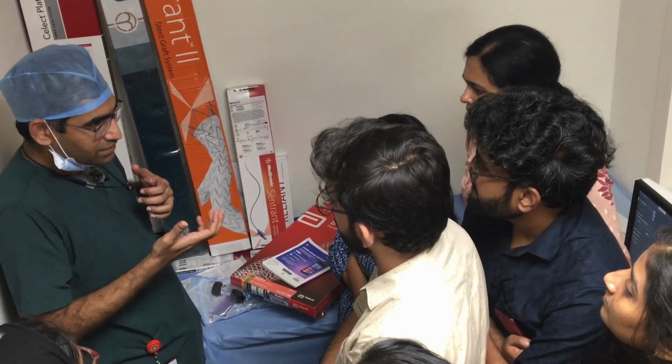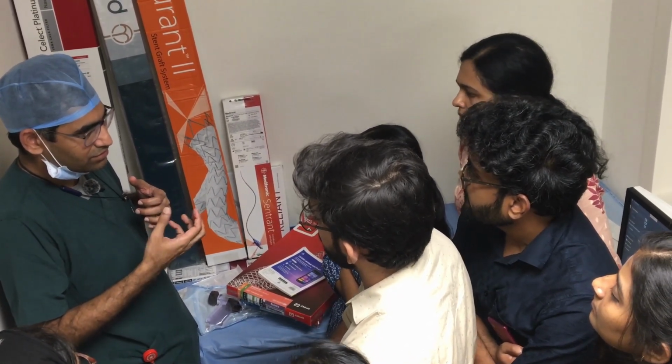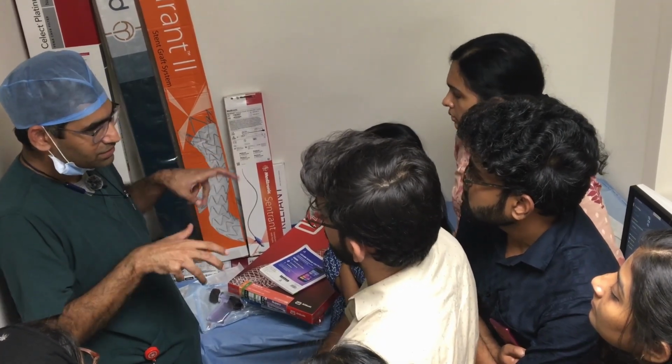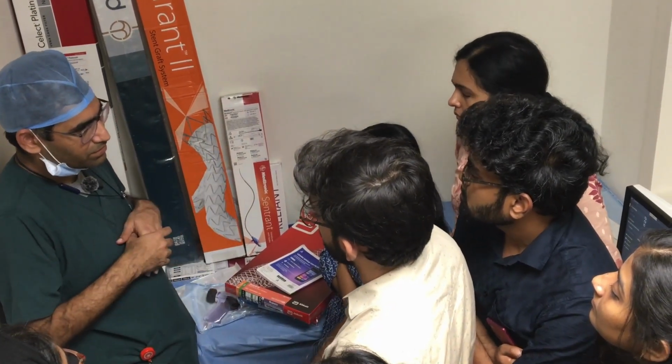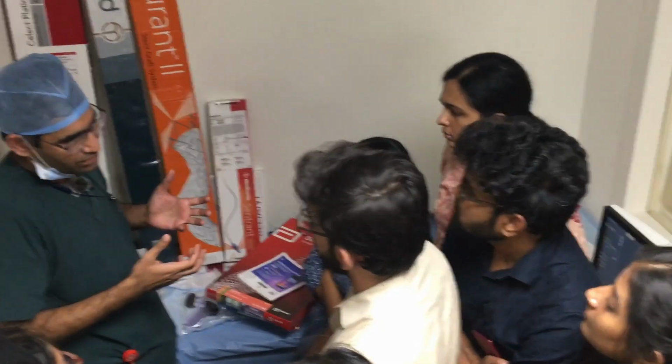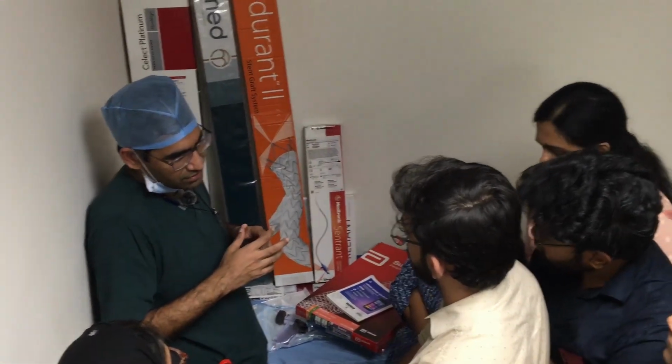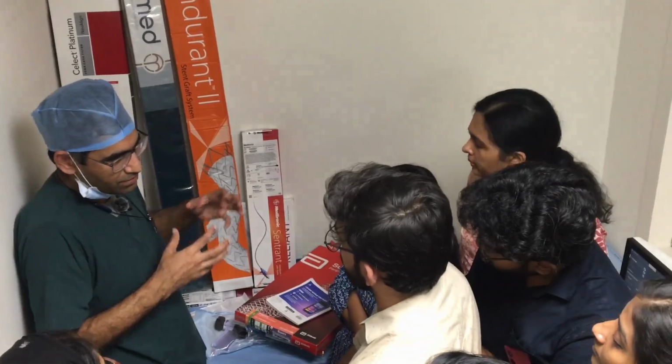If you are using it for dissection, in dissection the vessels are very friable. You don't want the barbs. Barbs will puncture and produce an endoleak, and it can rupture the aorta also. So the stents which are used in dissections don't have barbs. They are plain.